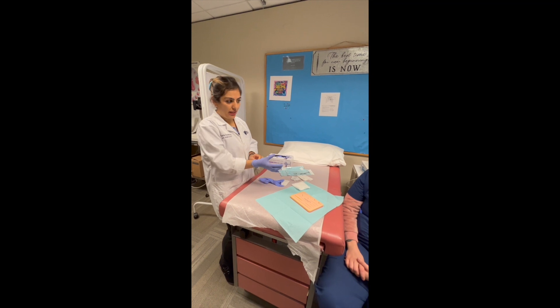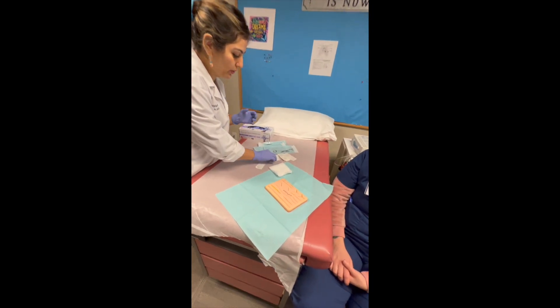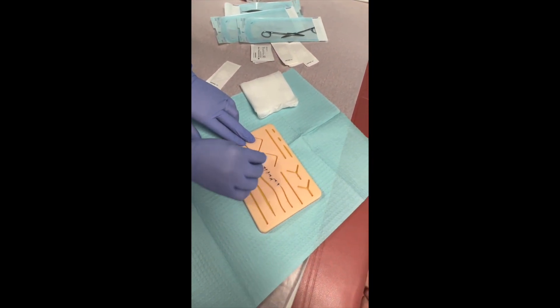Can you tell me if you have any allergies to anything at all? No allergies. Perfect. This alcohol wipe is going to be a little cold. I'm going to start from the middle and work my way out, making sure to clean the area.